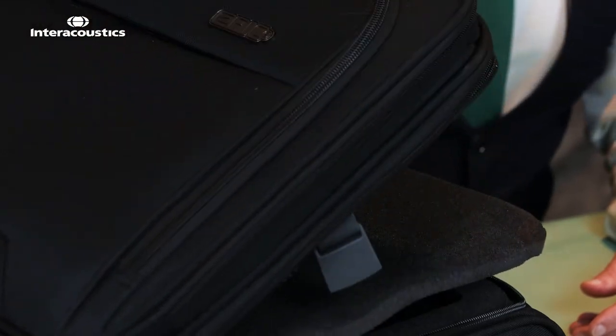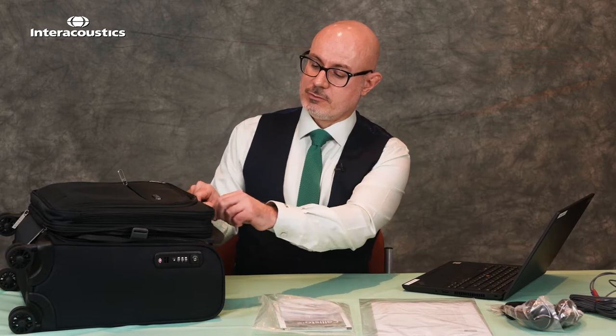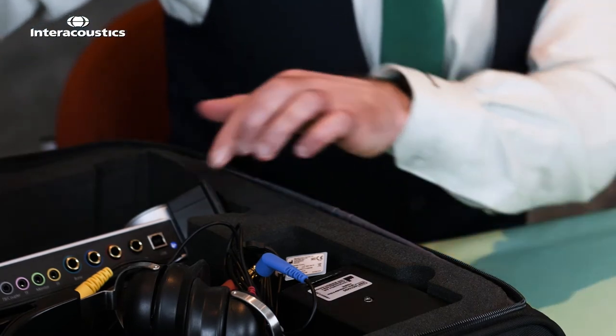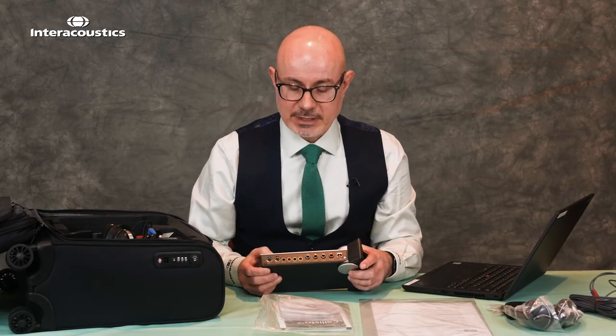Here we have the bag, and for those of you using this as a portable solution we have a section at the top to hold the laptop. As we open up the bag to have a look at all of the Callisto features, we can take out the unit and let's have a look at the ports to begin.